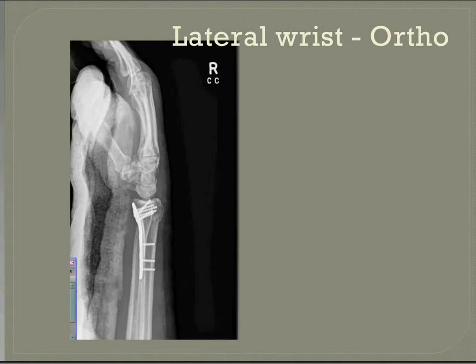It's just that the request, when we always say get a true lateral, it doesn't necessarily mean that the radiographers are thinking the same thing. That's what I'm trying to say.